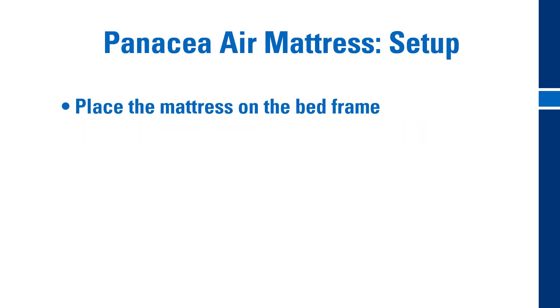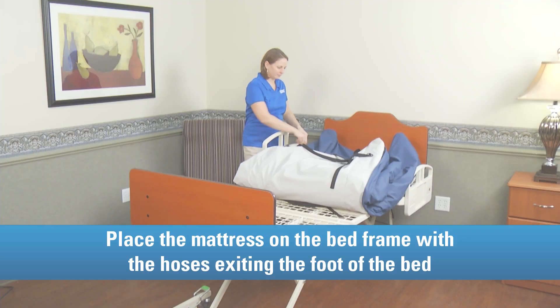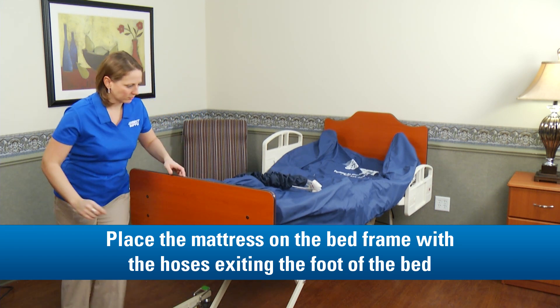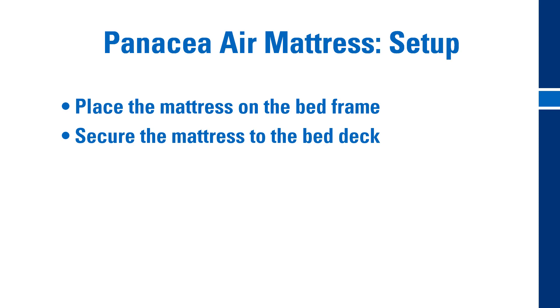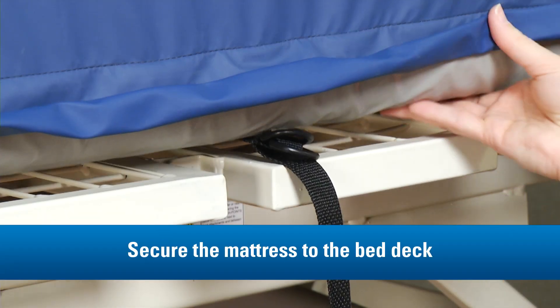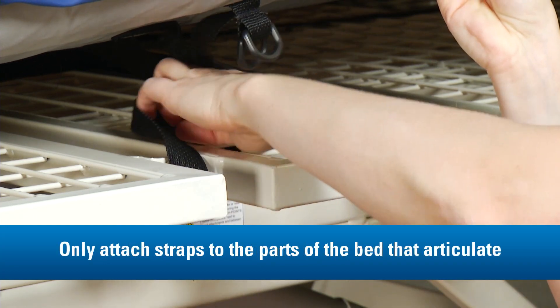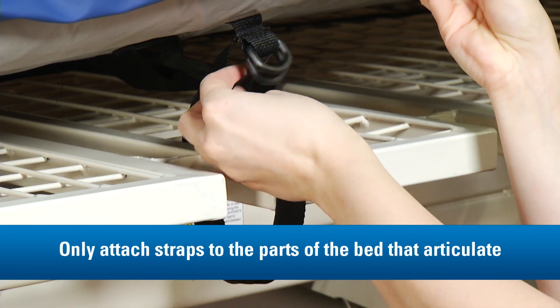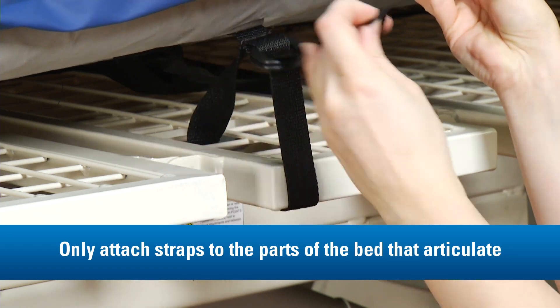First, place the mattress on the bed frame with the hoses exiting at the foot end of the bed. Then, secure the mattress to the bed deck. Be sure to only attach the straps to the parts of the bed that articulate, not to any stationary parts of the bed frame.